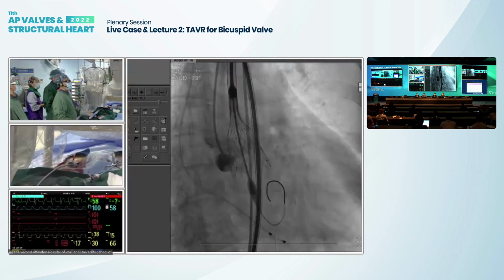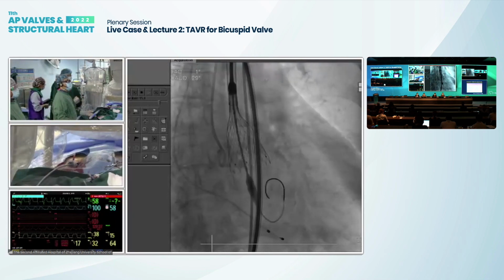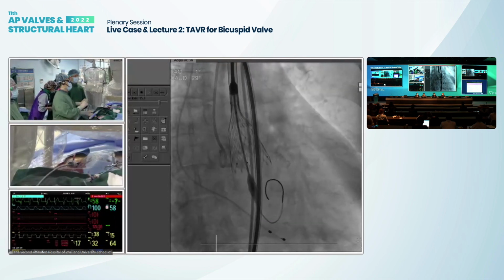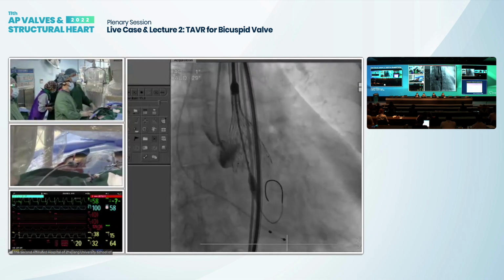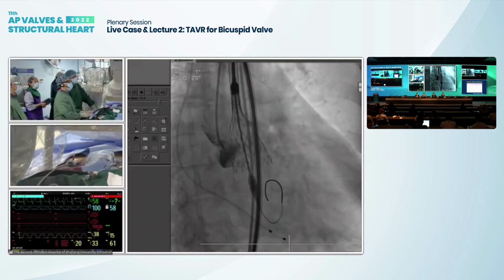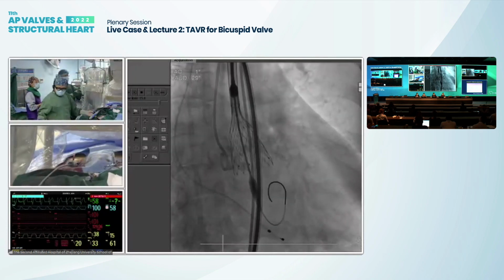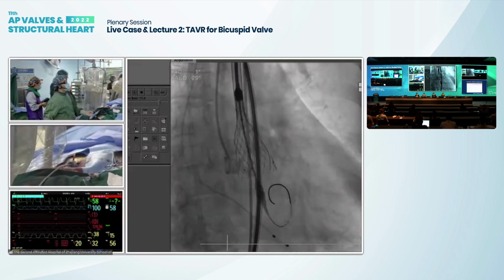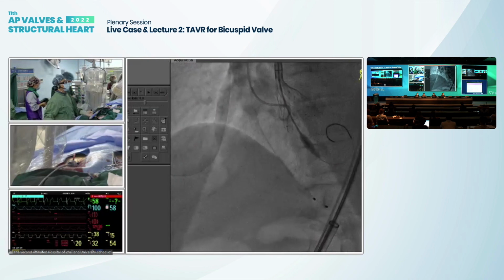Okay. So what do you think? We fully release it? It looks good on the non-coronary side. Are you comfortable with that, or do you want to check the left side? Are you comfortable? Okay. It will still adjust a bit. So move to the LL view.